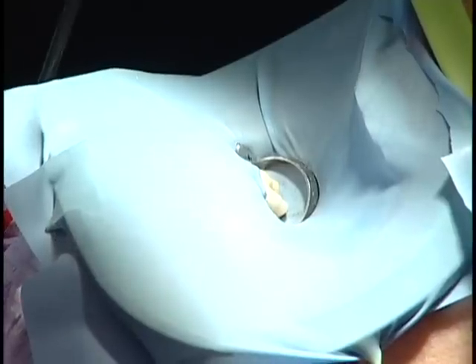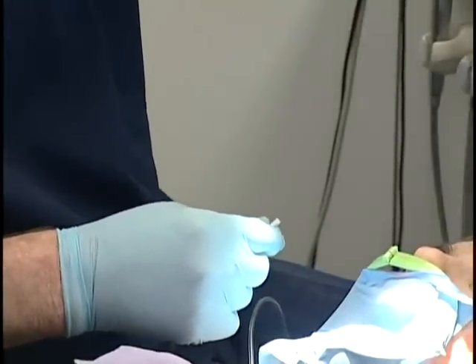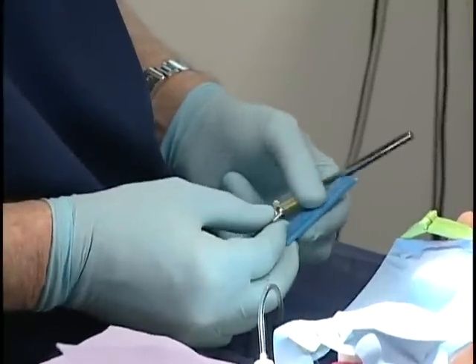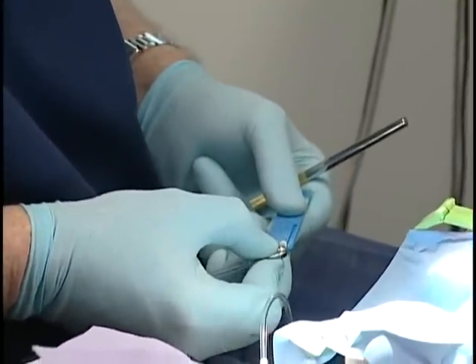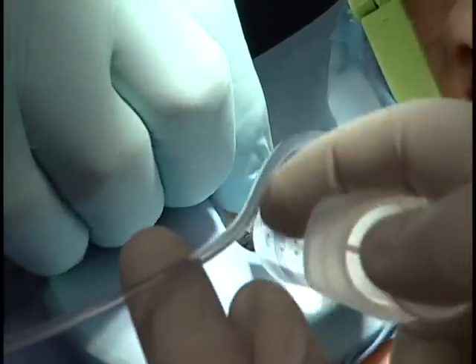Here, I'm taking the handpiece with the macro cannula off the suction tube and replacing it with the small finger piece and micro cannula. I'll set my rubber stop for length before I start the canal. I'll take the micro cannula all the way to working length while Jennifer continues to irrigate at the access with the master delivery tip.